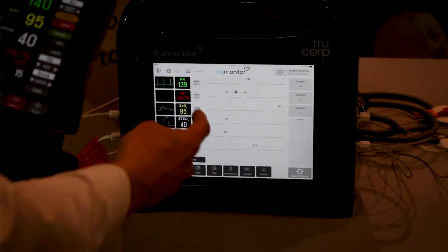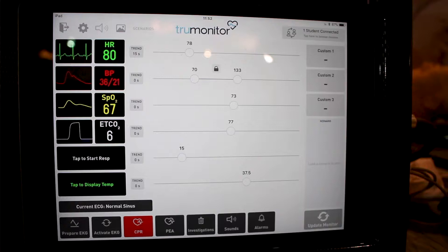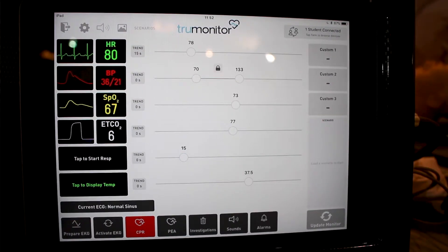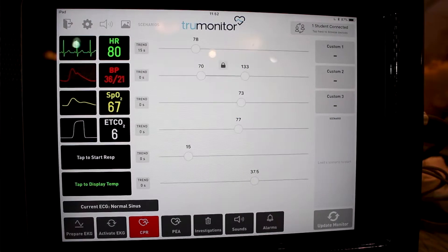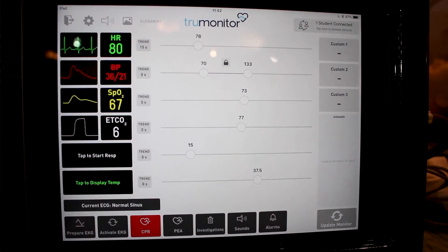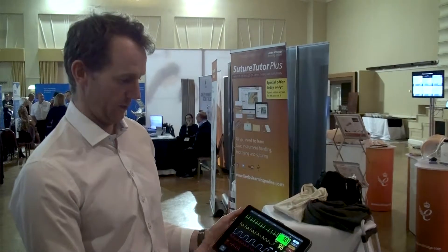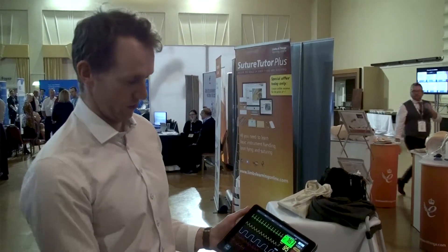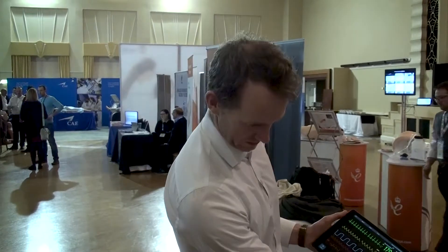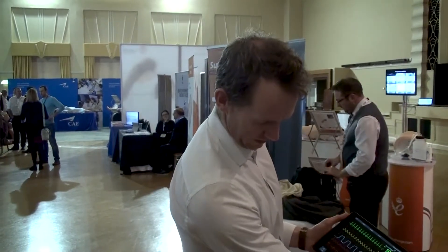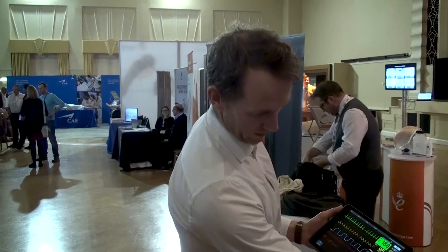For example, I can set the heart rate to trend upward over 50 seconds. Then I, the trainer, can sit back and walk away while the values start to progress up, up, up. All the vital signs — blood pressure, SpO2, and capnography with CO2 — can all be trended the same way.